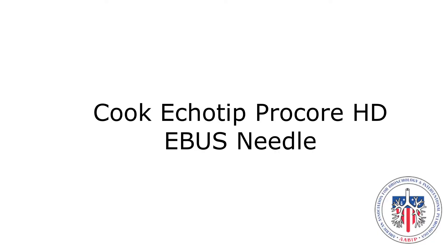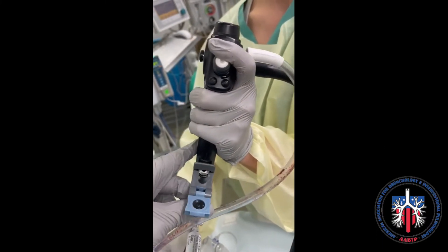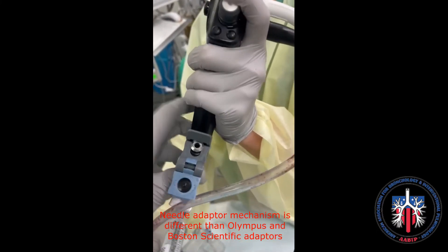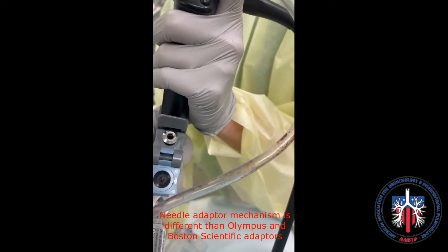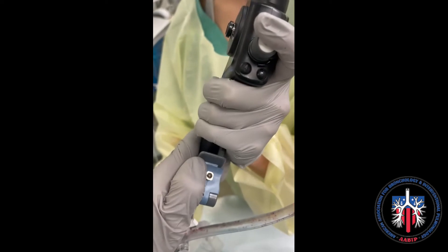The Cooke Ecotip Procore needle is available in 22 and 25 gauge. The use mechanisms of the needle are demonstrated here.